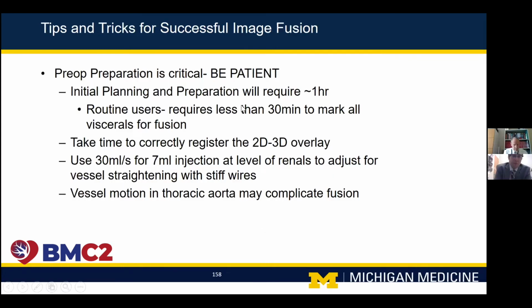Really, once you've done that, you're able to adjust if you want to for the iliacs. But I think there are some really useful tricks and tips for doing this. Having used it for the last 2.5 years on every case, we've learned that you just have to be patient.